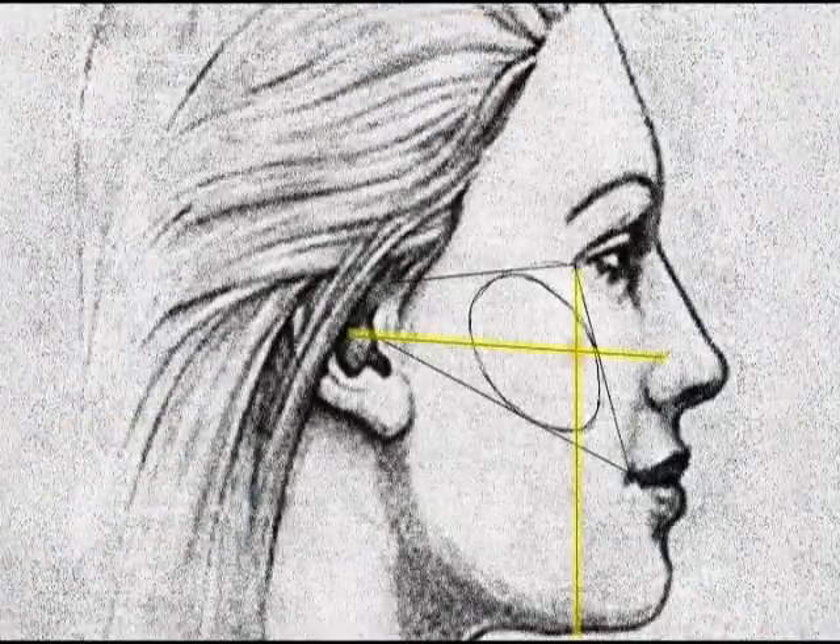Where this line intersects this line tends to be the most flattering place for the maximum curve of the cheek. Most people, especially if they don't have very nice cheeks, it helps to give them almost an egg-shaped or ovoid curve. I connect the lines and make an ovoid shape between them. I don't want my maximum cheek curve to be any farther forward than this, or any lower than the line between the tragus and the oral commissure. But I want it to extend up over the outer zygoma.